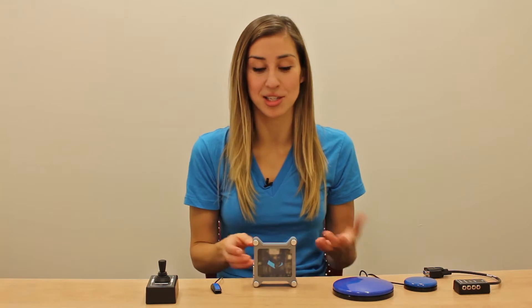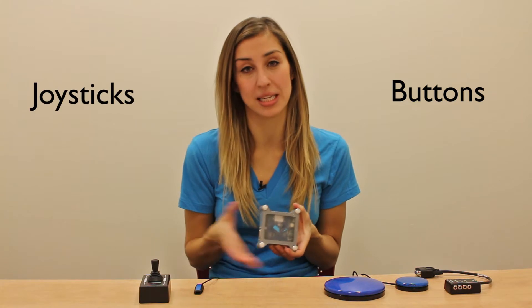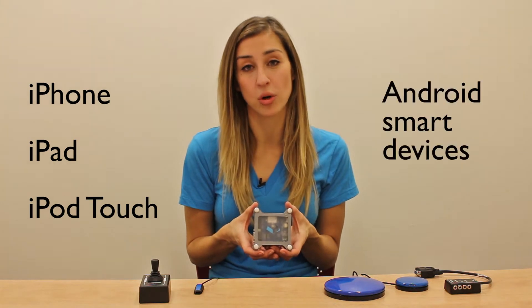Hi, I'm Elise and I'd like to introduce you to the Tecla Shield, a device that connects users with limited upper body mobility to touch screen devices. This is the Tecla Shield, which we use to wirelessly link to our accessibility switches like buttons or wheelchair driving controls like joysticks, sip and puff controllers, head arrays, to your iPhone, iPad, iPod touch, or Android smart devices.